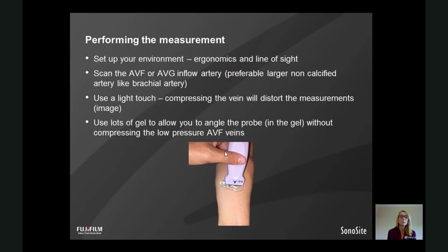Performing the measurement, it's really important with any ultrasound that we follow the same principles of ergonomics, that we make sure we set the environment up really well, make sure that the arm or the leg that we're planning to scan is in our line of sight of the ultrasound. We're not having to try and turn around to look at the ultrasound, that we line it all up. And also seat yourself at the right height so that you don't cause any strain to yourself.